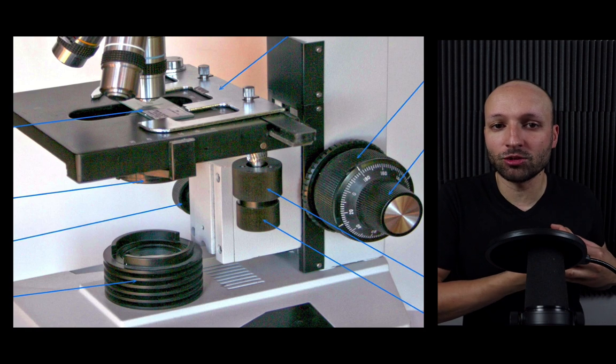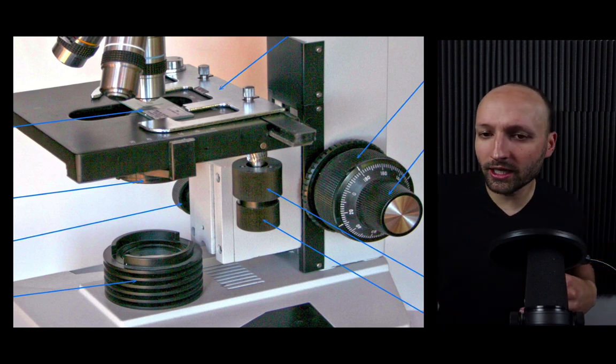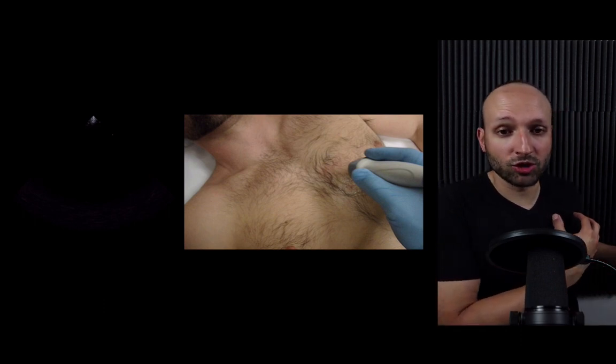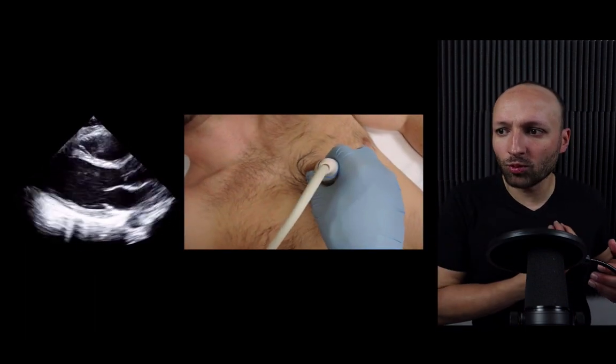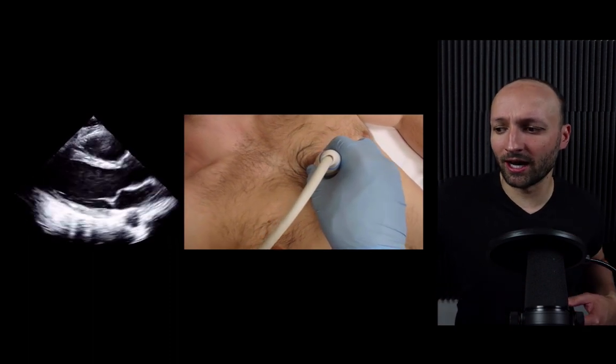Once you see the thing that you want to see, then you do these little fine movements to really hone in on it. And that's how I approach the parasternal view or any parasternal view, long axis, short axis, same thing. So I start off doing these big old circles until I identify something that looks like a heart. And then once I get to that spot, then I do little tiny tweaks to try and figure it out.